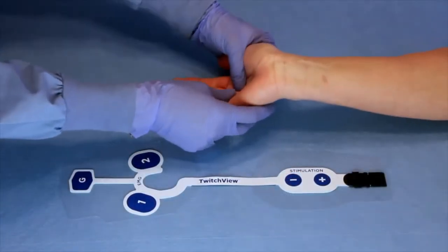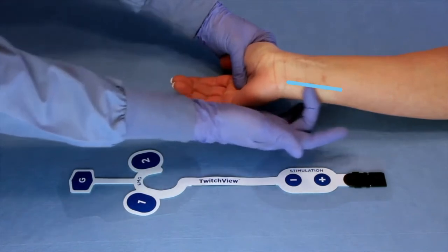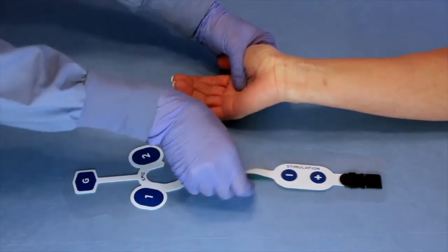To locate the ulnar nerve, extend the patient's wrist and the ulnar groove will become visible.